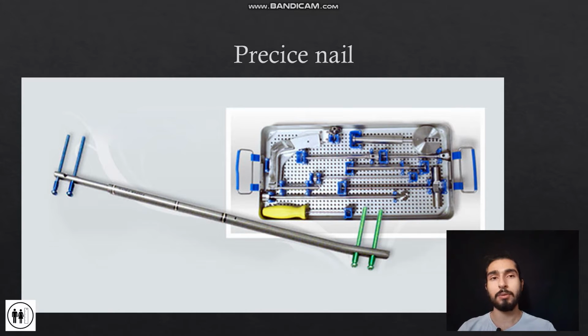Last year in 2019, the latest version of Precice intramedullary nail, called Stryde nail, was released worldwide. And the main improvement here is increased weight-bearing capacity. Well, this one, which is the Precice 2 or Precice 2.2, this version wasn't able to support the patient's full weight. So you would need to use a wheelchair.